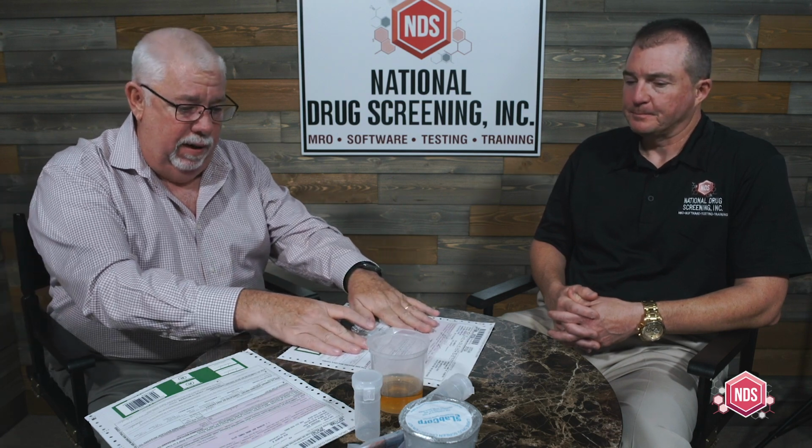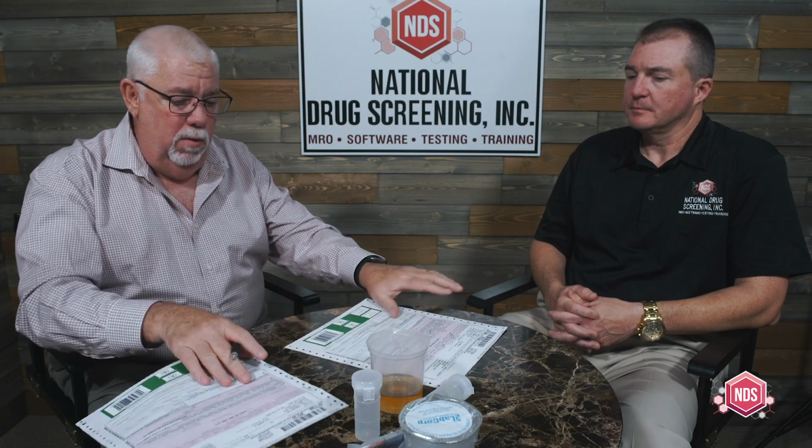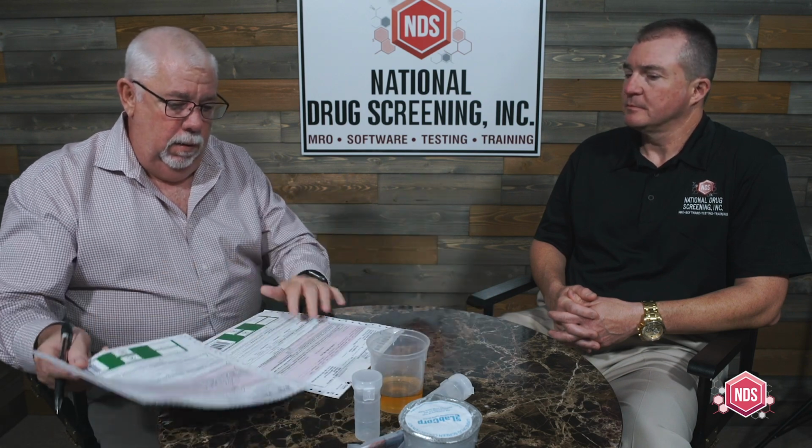Once we finish that first collection, we're going to move on to the second collection. In the second collection, I'm going to fill out all the same information that I had from the first collection in step 1, what we call the administrative section of the form, and then I'm going to make sure your pockets are still empty and that you've washed your hands. I'm going to have you pick a collection cup.